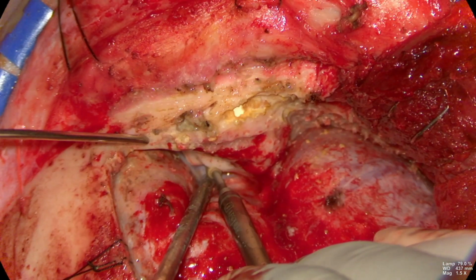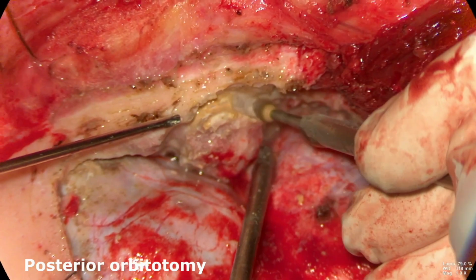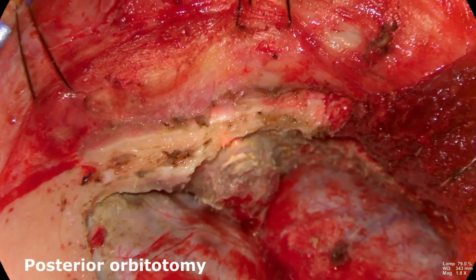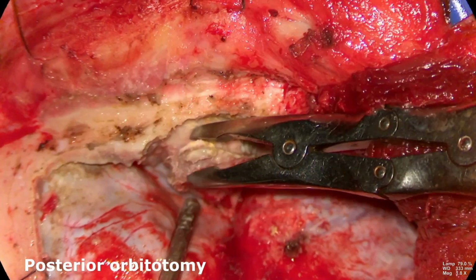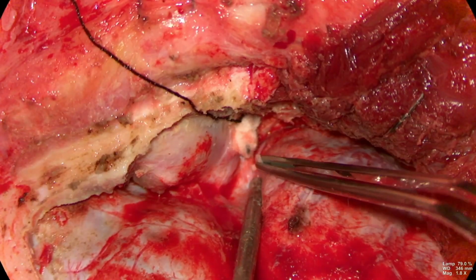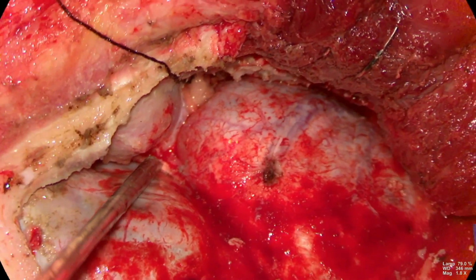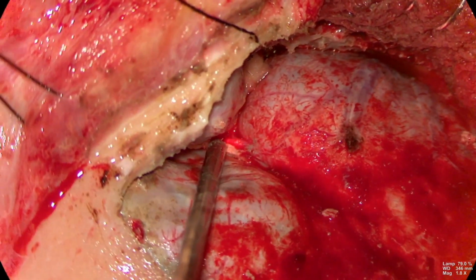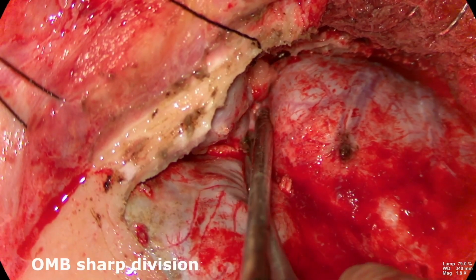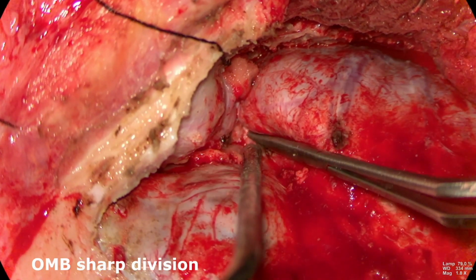Now we are performing the posterior orbitotomy. We should take utmost care not to injure the periorbita. Horizontal segment of superior orbital fissure is exposed, sharply dissecting the orbitomeningeal band from the anterior clinoid process, and now dividing the orbitomeningeal band in the line of dural groove.